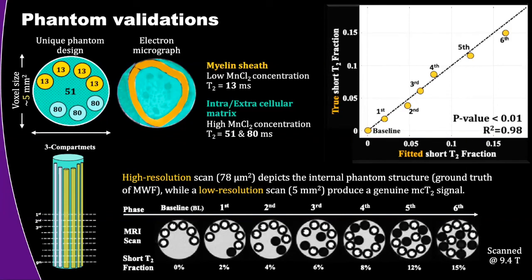This is a wonderful presentation. Thank you so much. So my question is, how does this fast spin echo-based approach compare to GRE-based approach in the sense of the accuracy and the reproducibility of myelin water imaging? So GRE approaches, and there are several approaches that are based on GRE, are being used for myelin water fractions.